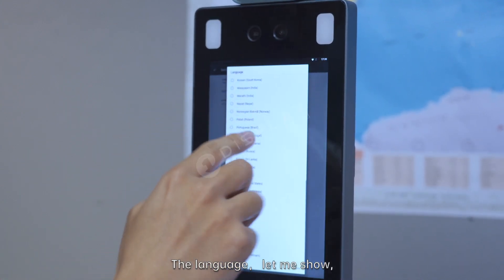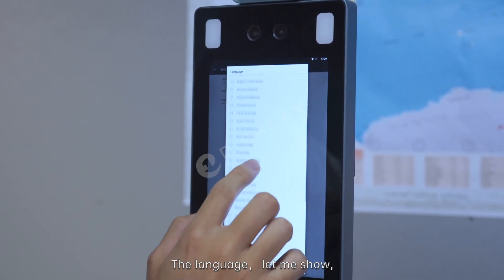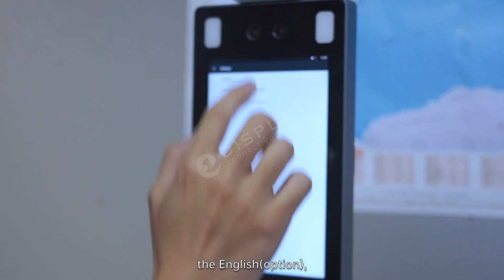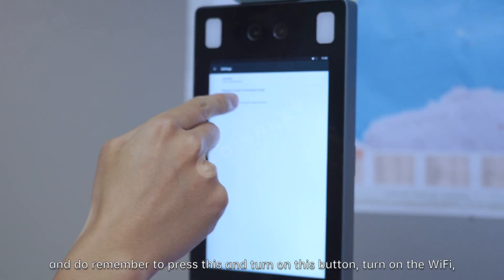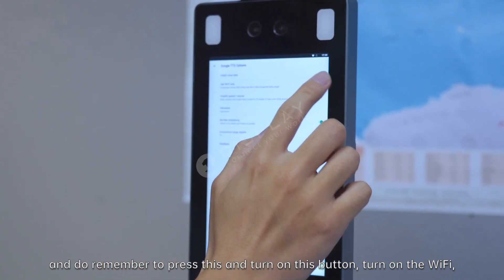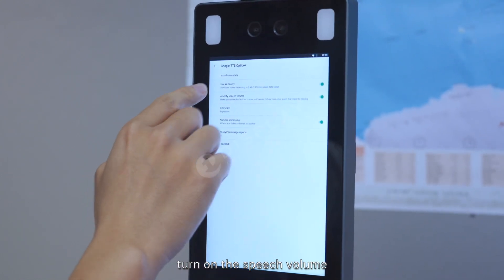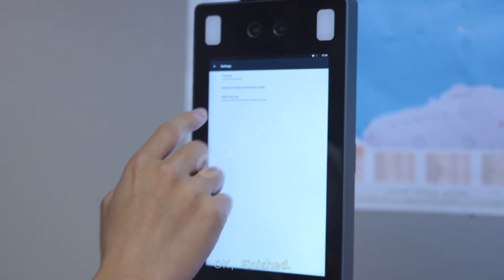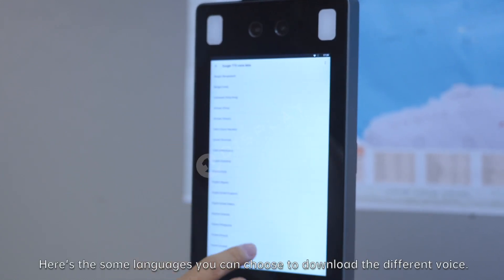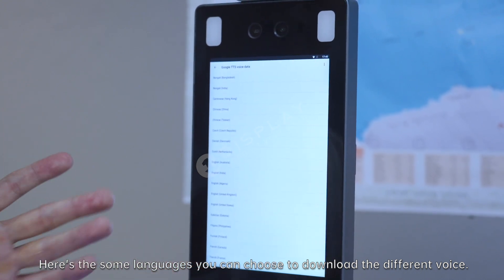The language — let me show — English. And remember to press this and turn on this button. Turn on the Wi-Fi. Turn on the speech button. Finished. Here are some languages you can choose to download the different voice.